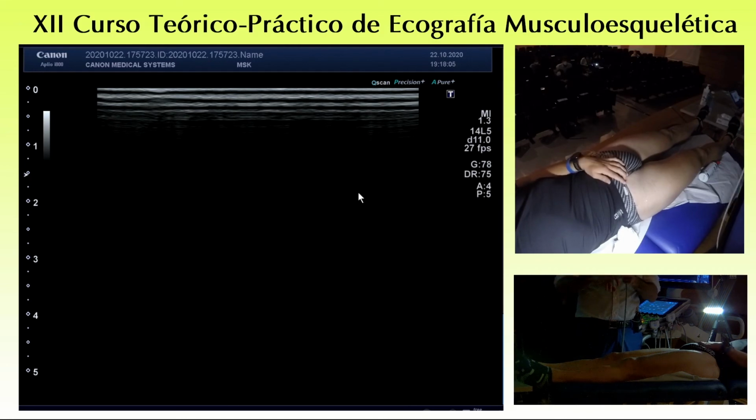So when you have a lesion of the indirect tendon, you have a pulling on the capsule from the reflected component, and this can create damage in the capsule and some fluid around it, because the indirect tendon inserts directly over the acetabulum, and there is no reason to see fluid around the capsule.